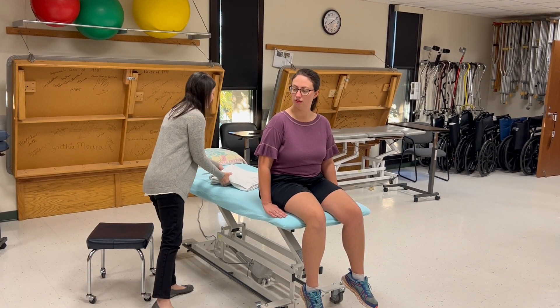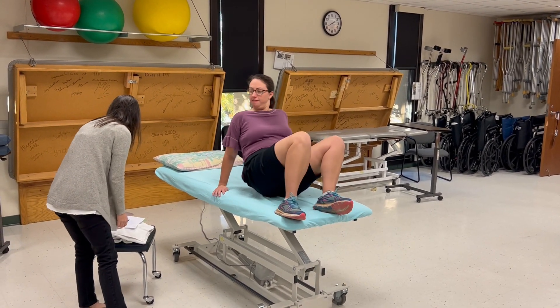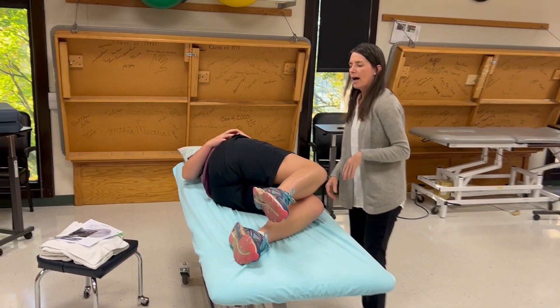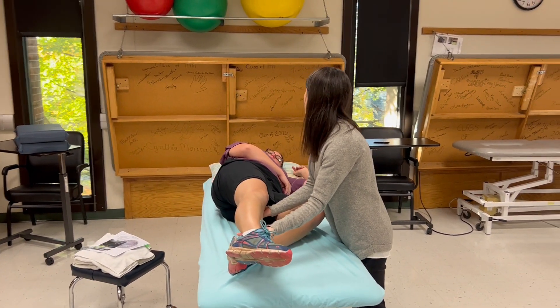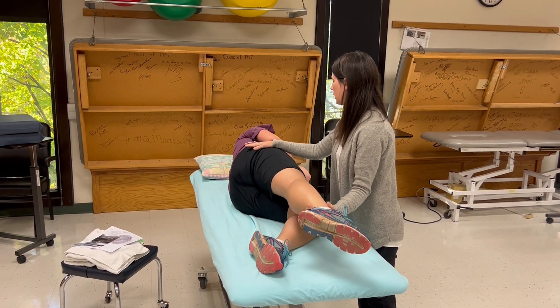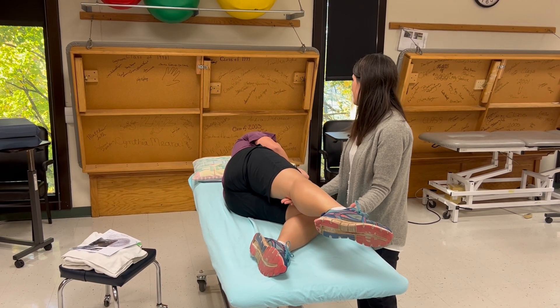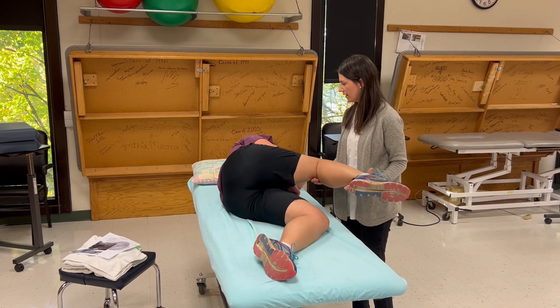For gravity eliminated testing, the patient lies on their left side since we're still testing the right leg. I stand in front and support the leg out straight. I want the patient fully on their side — not a quarter turn toward supine. I stabilize proximal to the knee and proximal to the ankle, then ask her to bring her knee all the way to her chest. She can bend her knee too.